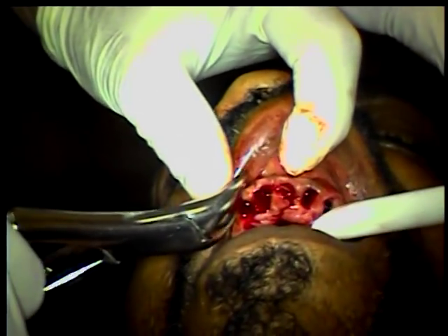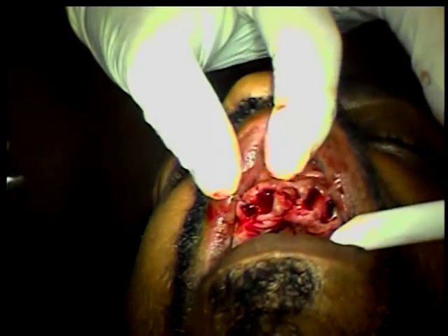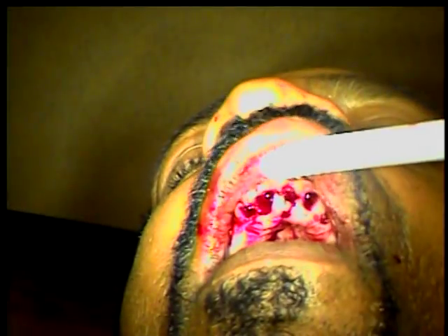And then the tooth always comes out. I didn't know the root was that little. This patient's had terrible experiences, haven't you?